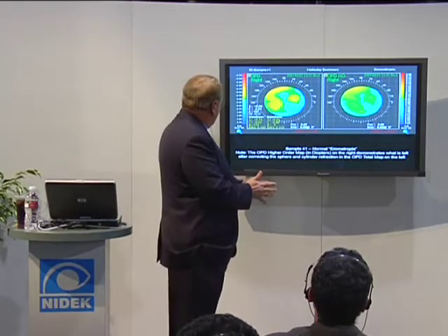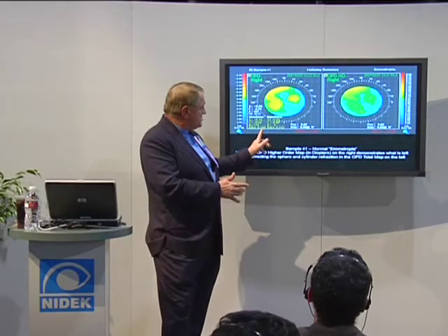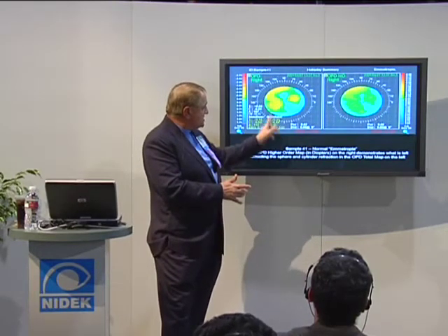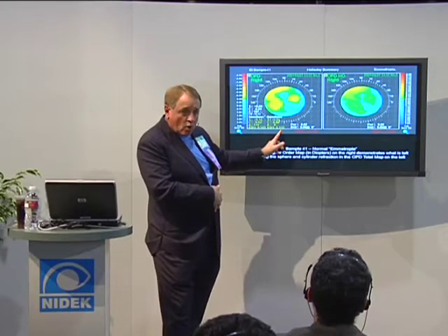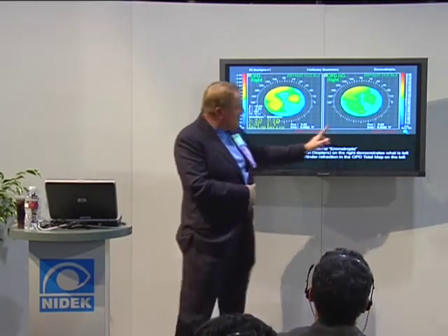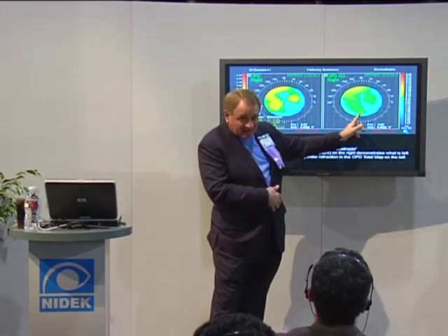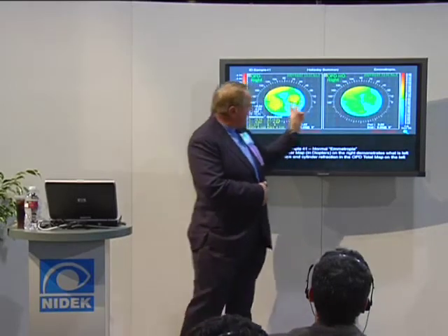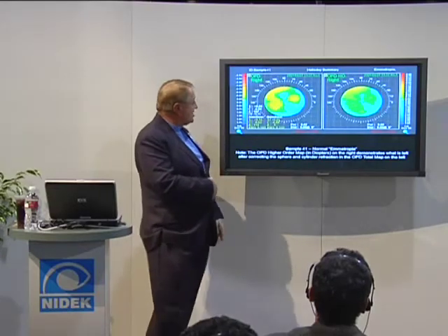The RMS here is again in diopters. What this is showing you is that this person, over a six millimeter pupil, has a variation over the surface of the cornea of 0.31 diopters for the whole eye. Over here it doesn't have the RMS value, but it would be a lot less because the refractive error would go away. The main thing is this is what's left after you take the refractive error out of the whole eye.